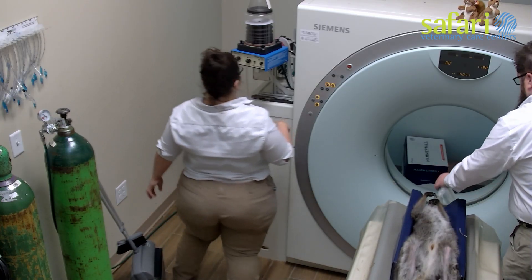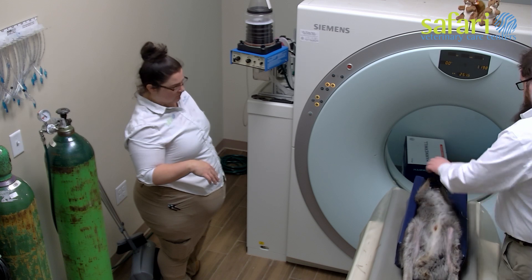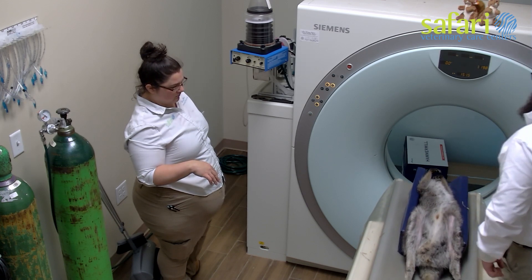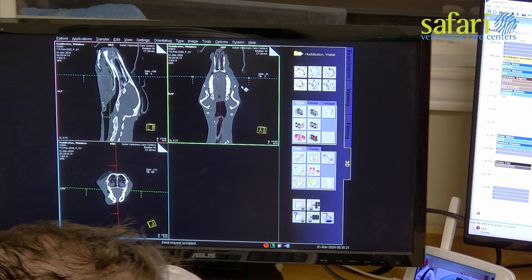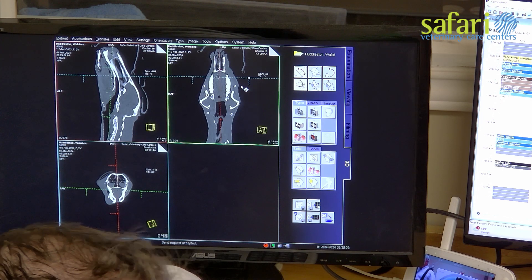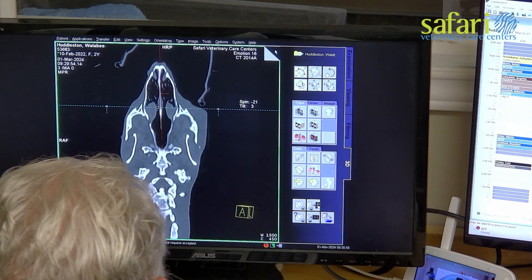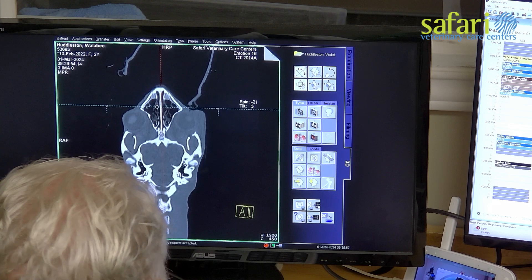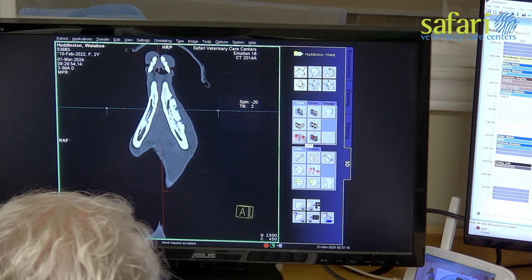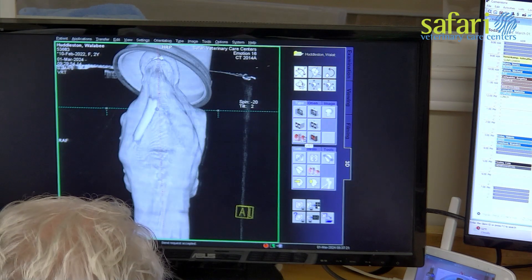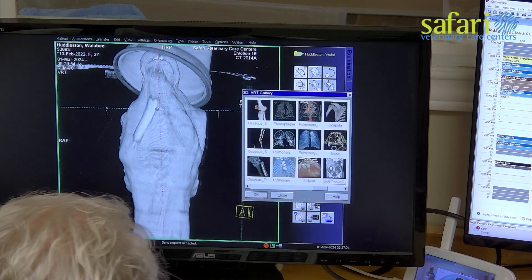The CT scan reveals that the wallaby has lumpy jaw disease, an infection common in cattle but not necessarily in kangaroos or wallabies. The images come slice by slice; each slice is 2mm thick, providing a detailed view through the head, which is then rendered into images that can be viewed in both 3D and 2D. While the entire head is scanned, today we are particularly concerned with the left jawbone.